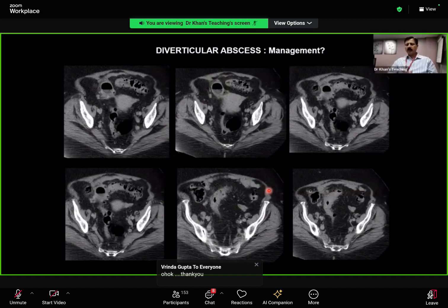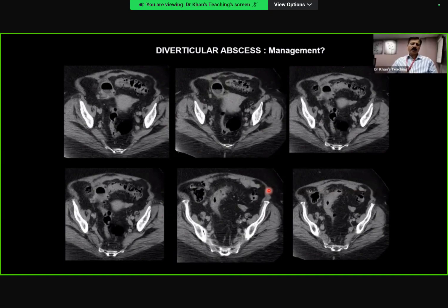I stopped you there. You had your IR session, and just to make a point is that in these kinds of films, they will ask you, and please remember the concept that if there is an abscess, usually it's interventional radiology they go for. They don't do laparotomy. They've got some criteria, clinical, but we're not going into that world.